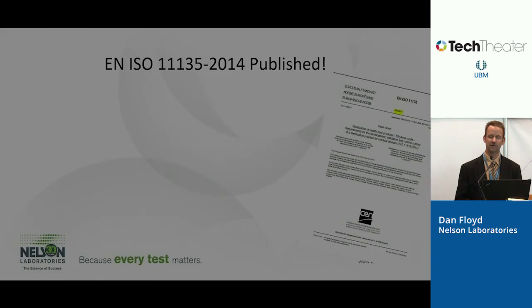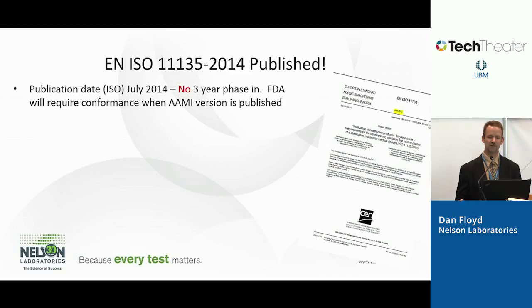So the ISO 11135 document, as we mentioned, was published in July of 2014, so going on a year ago was when the EN ISO version published. The US side is a little bit behind, and the reason is that once AAMI decides to adopt the document, they take the ISO document and adopt it verbatim, but it also has to go through ANSI, the American National Standards Institute, to get voted on.